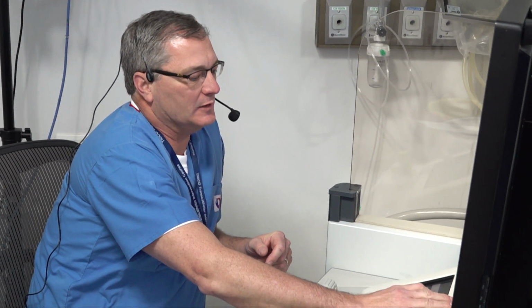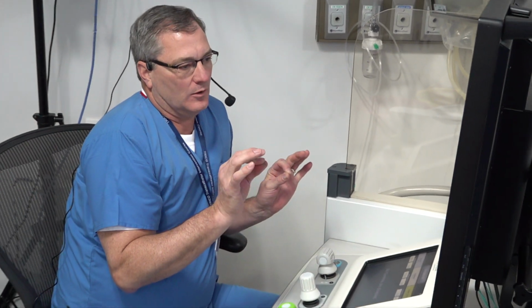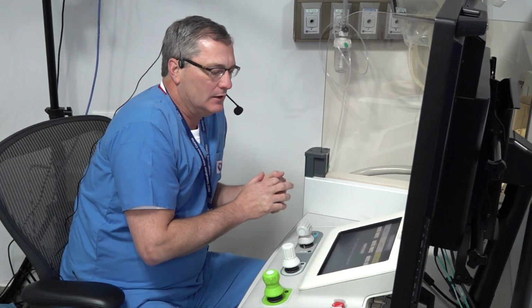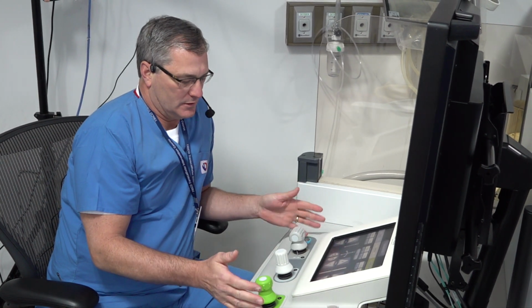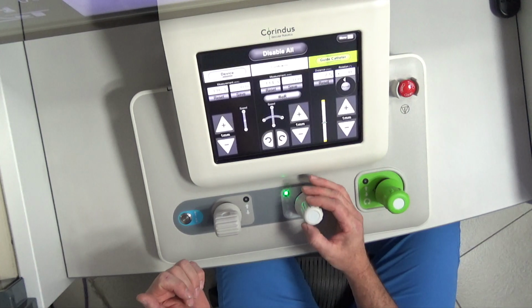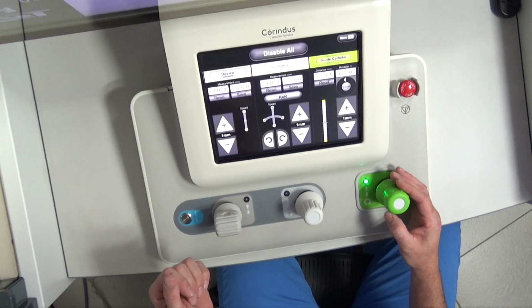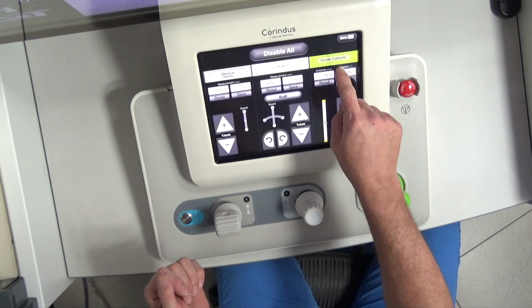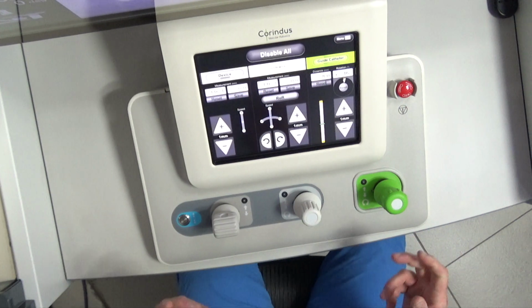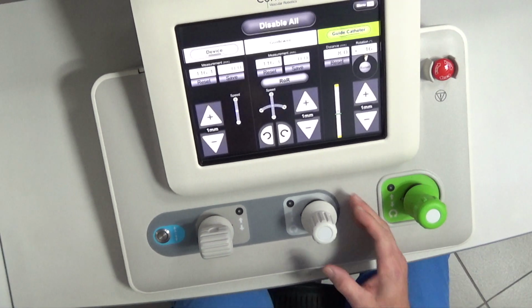You can see on the robo cockpit, you've got a touch screen panel. After they've put a workhorse wire with a bend and a 2.0 balloon into the guide, they turn it over to me and I push enable all, which gives me control of all three joysticks. One to drive the device, one to drive the guide wire. This one will spin and go backward, forward, and one to drive the guide catheter. It will also spin, go backward, forward. You can disable each of those individually so that if you grab the wrong handle when you're learning, you don't move anything inappropriately. I'm going to leave them on. So we're all set up.